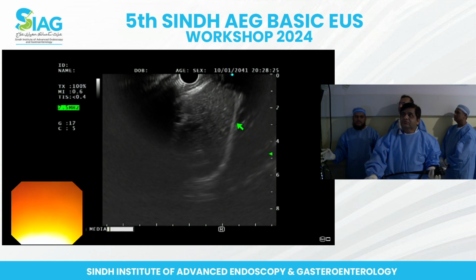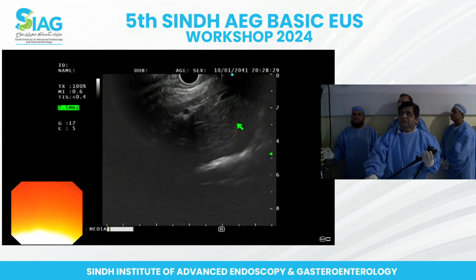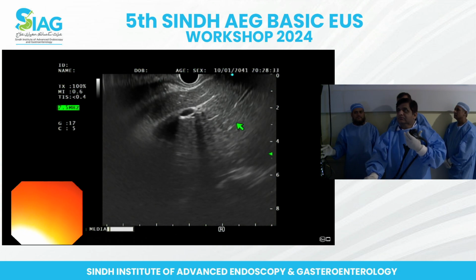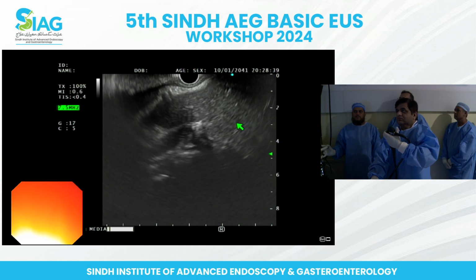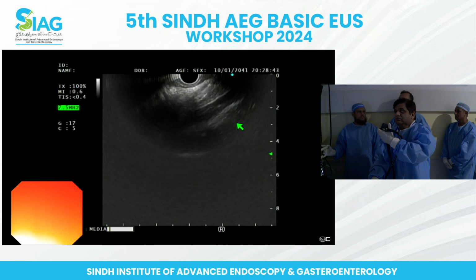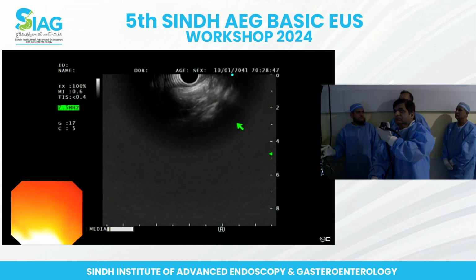So you're back at the liver, and you can see the beating heart right on top of the diaphragm. So turn clockwise, move your shoulder and your body, and keep turning to the right, clockwise rotation, and slight pullback, slight pullback. Okay, good.